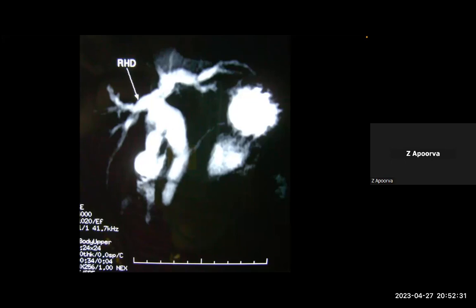Sir, is this an MRCP study? Okay, so this is an MRCP study delineating the intrahepatic and extrahepatic biliary structures, showing uniform dilatation of the intrahepatic and extrahepatic bile ducts, and the right and left. What does uniform dilatation mean? When you said uniform, you meant something specific. What does uniform mean?